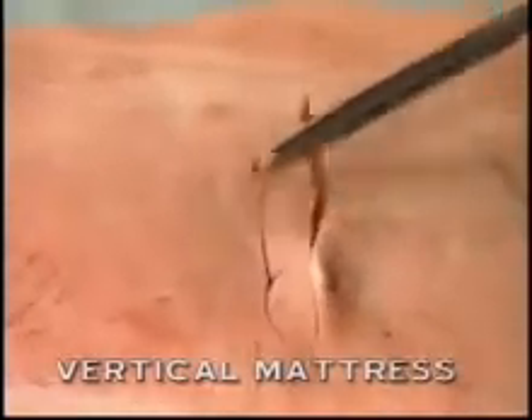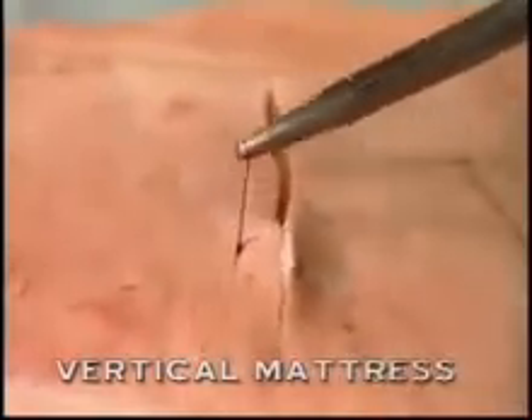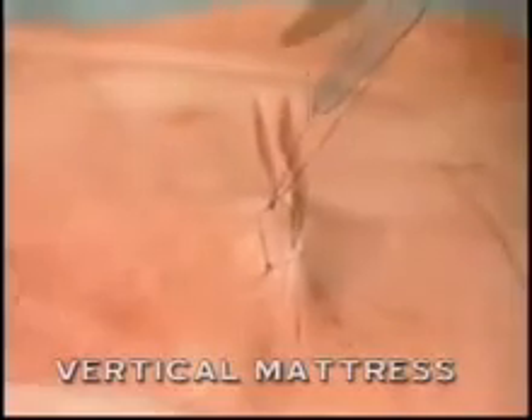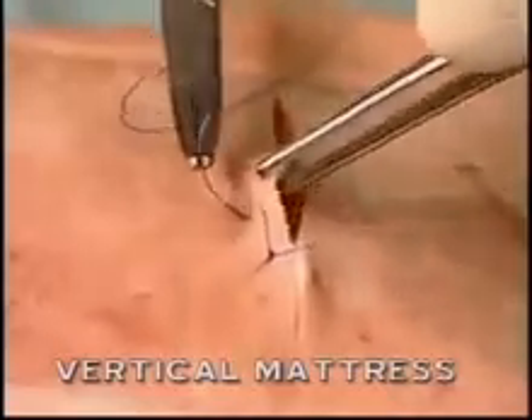The suture is then tied. This is the vertical mattress suture — as you can see, it gives a close approximation of the skin edges.